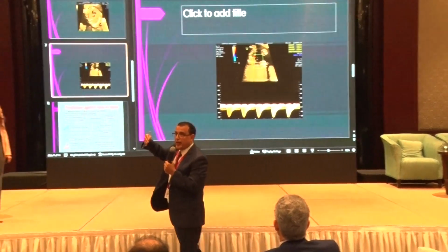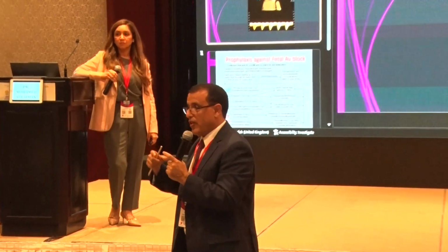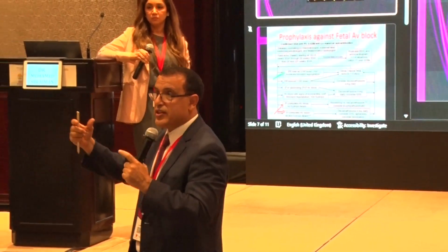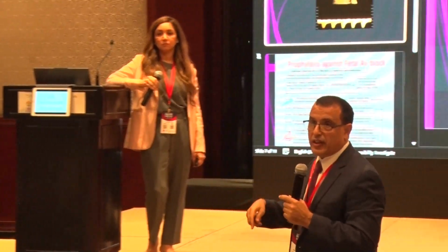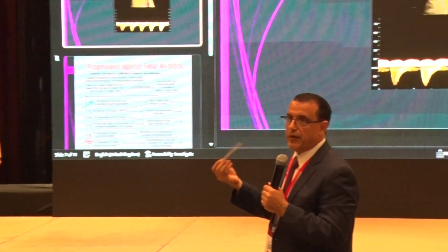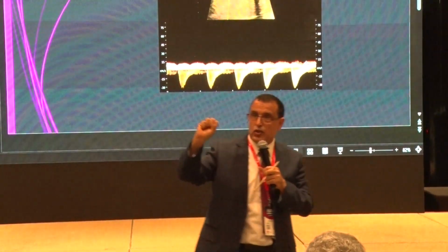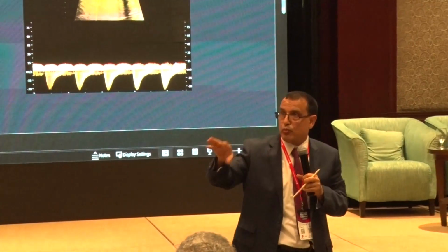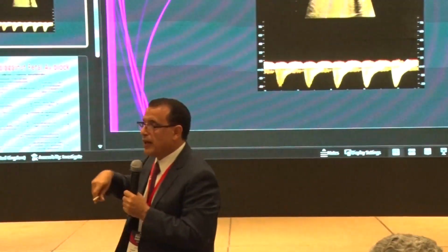What else are we looking at for the cardiovascular profile? We look at the heart size. So if the heart is more than 1/3, or 1/3 or less. Okay? So this is the second thing. What else do we look at? The function of the heart. Okay? So we look at the function. That will also give you 2 points, either minus or plus. Yeah. What else are we looking at?